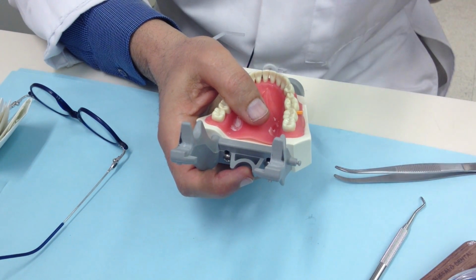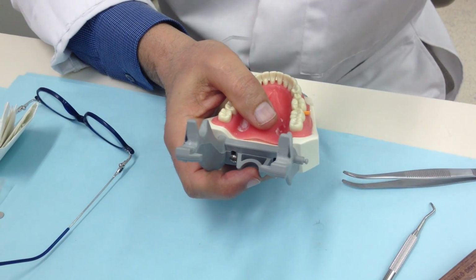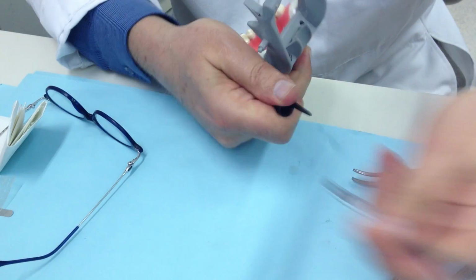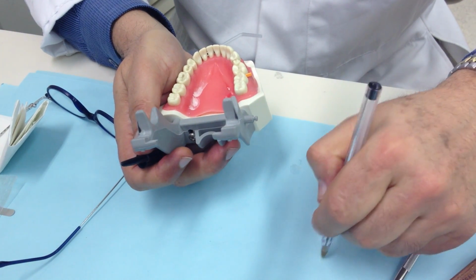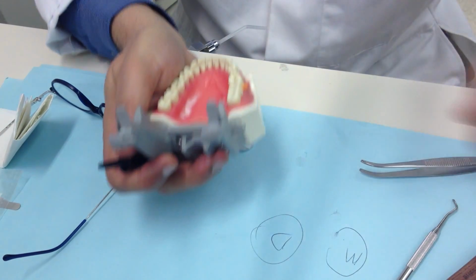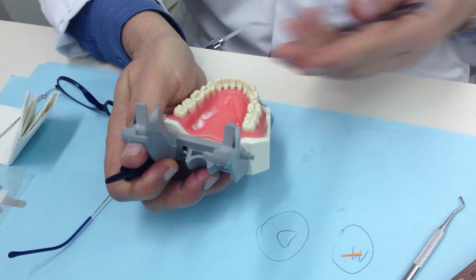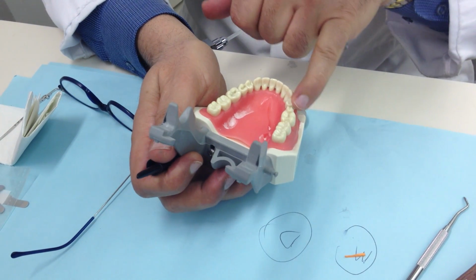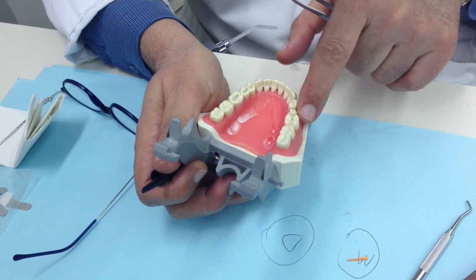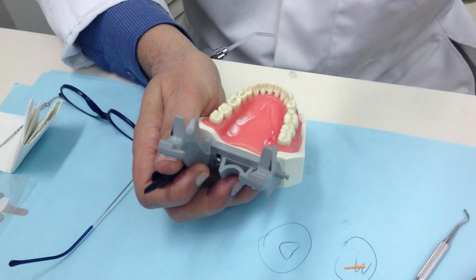If there is a MOD, do you have a pen? I write over here M, I write over here D, so when I remove the wedge out, I know exactly where I'm going to place it. Now I have no problem here, because I'm not going to place a wedge on the other side. The reason I don't place it is because there's no adjacent tooth, otherwise I have to do the same thing for both sides. Are you with me?